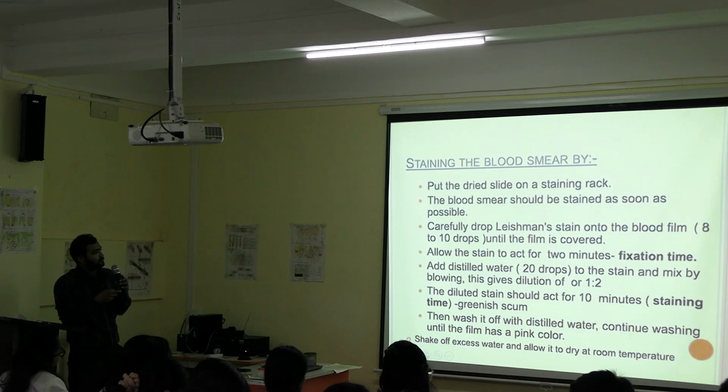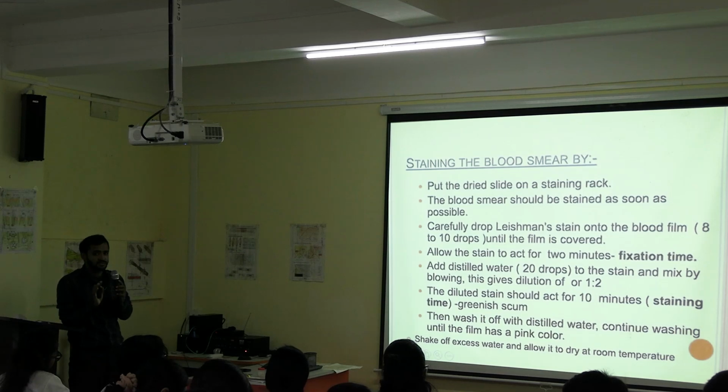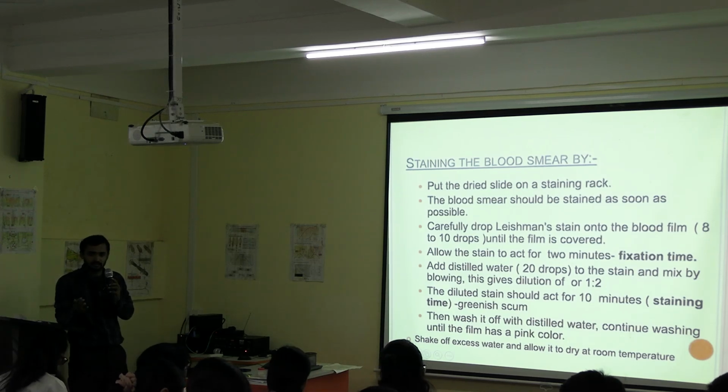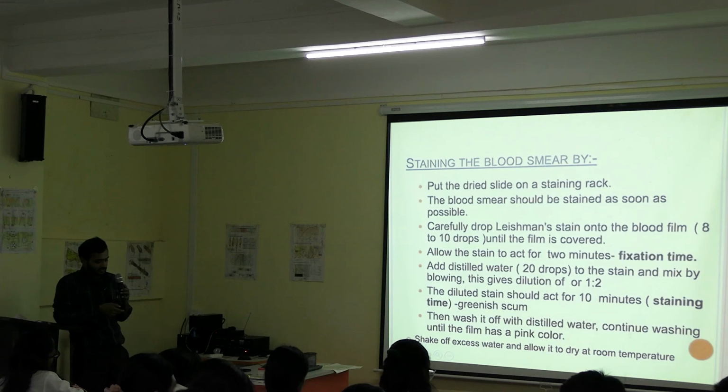Here we wait for 2 minutes, and then we add double the amount of distilled water. Here we are using distilled water, not tap water. In the exam you have to use distilled water. If it is not there, you have to ask. All the precautions you have to check, and you should make sure everything is on your table before starting the examination. If anything is not available, you directly ask, sir, this is not being supplied to us. So here we can add distilled water.